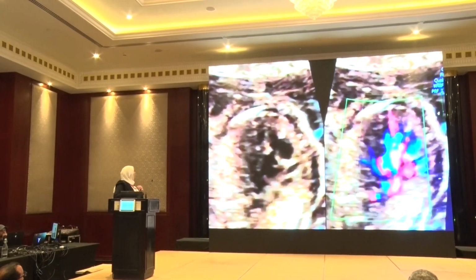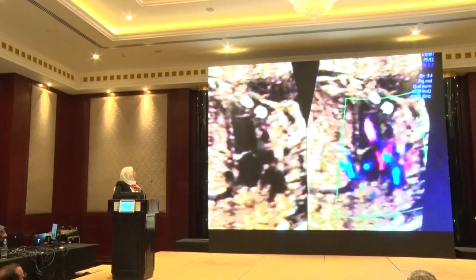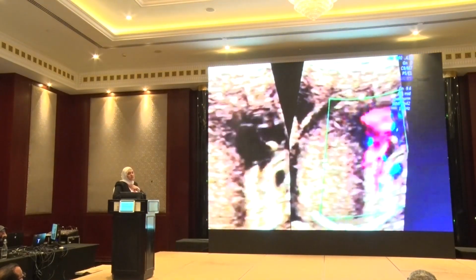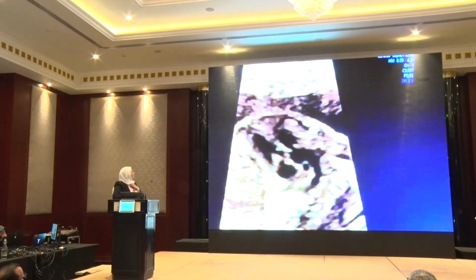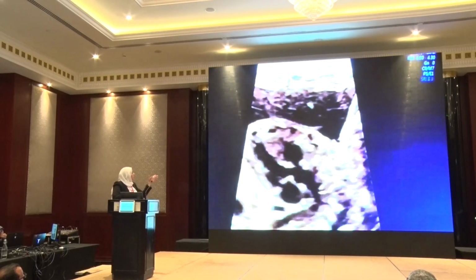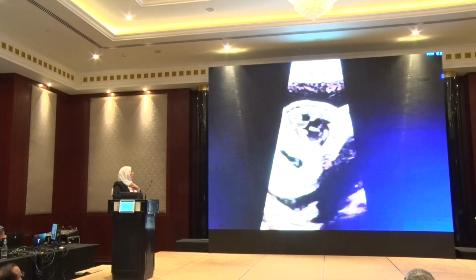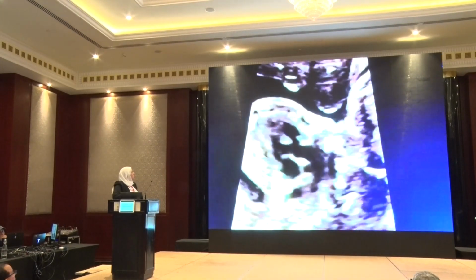We'll continue sweeping. I didn't see the pulmonary at that time. Then more sweeping comes in from the posterior part, the branching pulmonary. This was a case of truncus. Actually, it was type 1A, and at that time it was delivered in Latifa and sent to Jimi. I will keep it for more sweeping if you want to comment on it. This is the arch and the pulmonary.